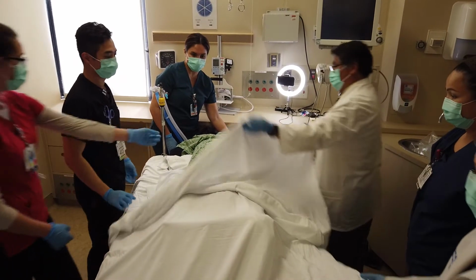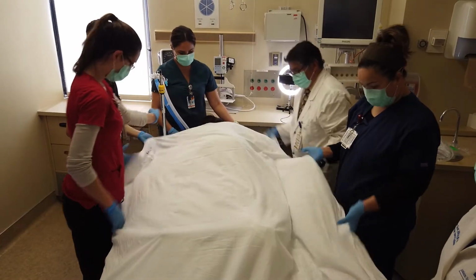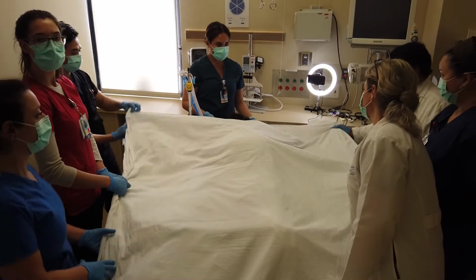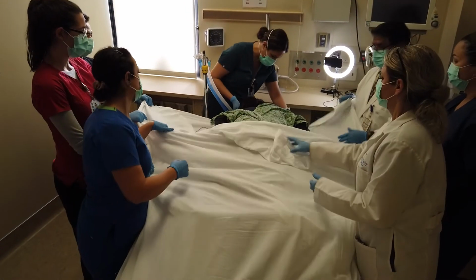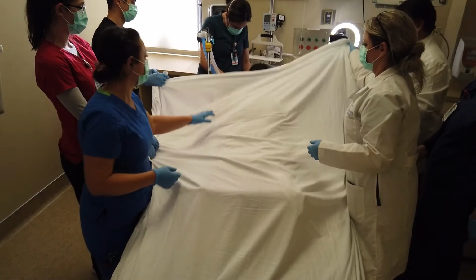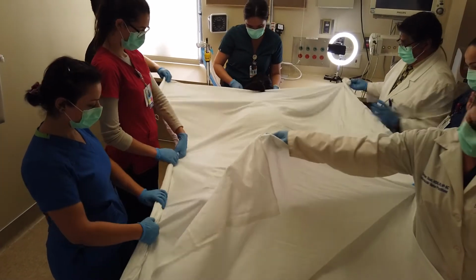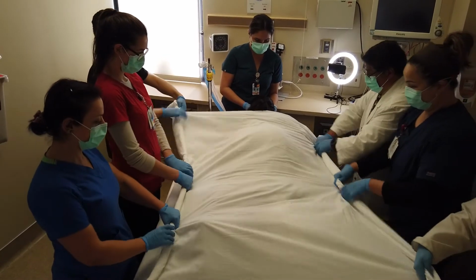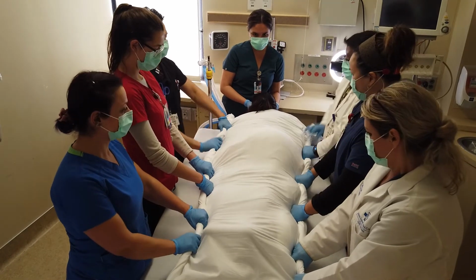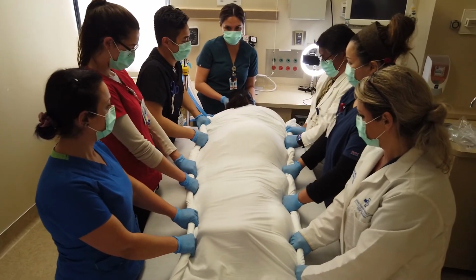Once the patient is ready to be repositioned back to supine, or simply just repositioning the head, we will be using the same method that we did with the prone team by adjusting the sheets, placing the patient's hand lateral to the body, and ensuring that we properly secure the ET tube and the IV lines during this repositioning phase. During repositioning, we will use this method where we apply the sheet on top of the patient, roll towards the patient. If we need to reposition the head, we will pull the patient up while the RT securely holds the neck and repositions it appropriately.